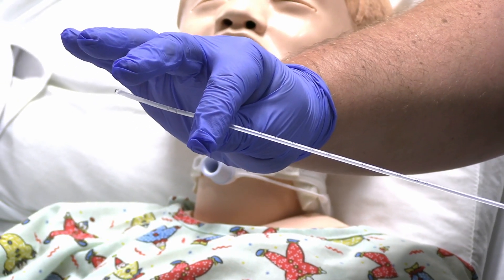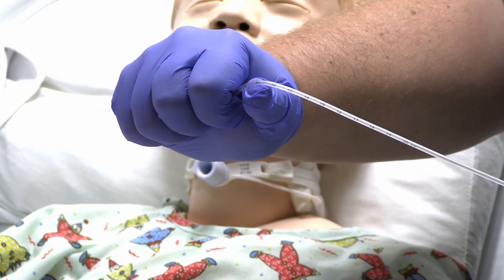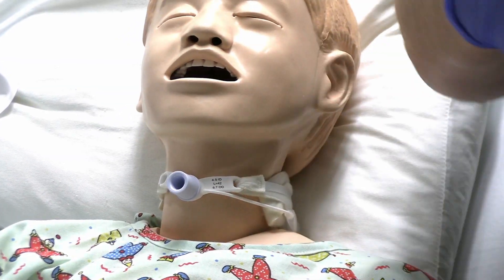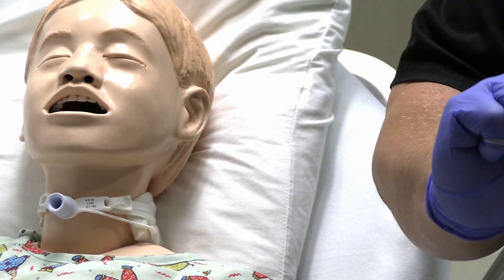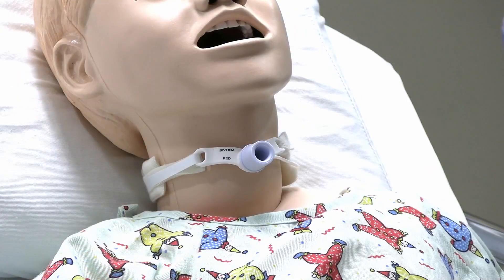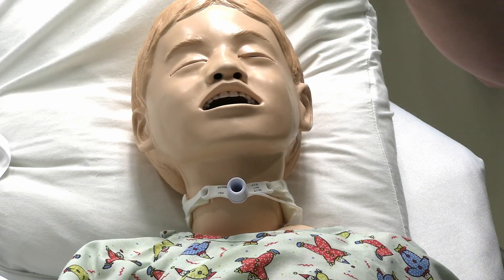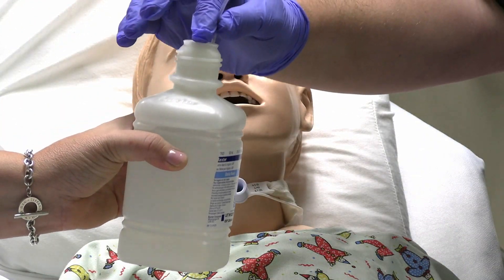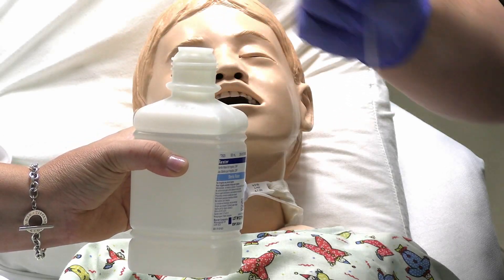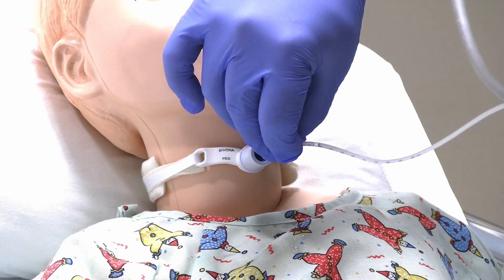I have removed the catheter from the packaging and it is now in my hand. I am going to close the tip of the tube, just wrap it, keeping my hand not touching anything and keeping the catheter clean. I will then have my partner give me some sterile water to lubricate it, and then I am going to advance it through the trach.